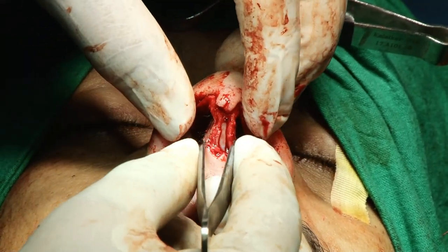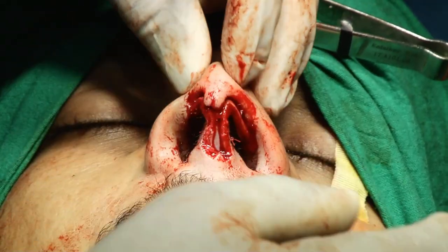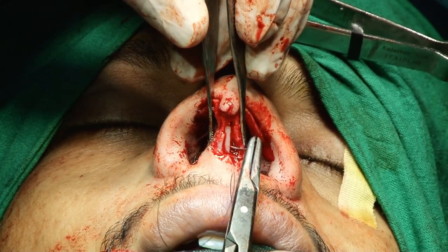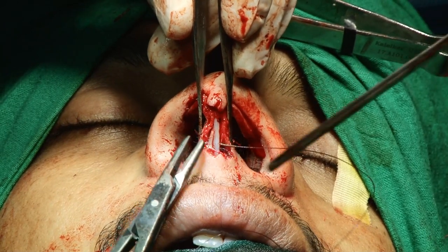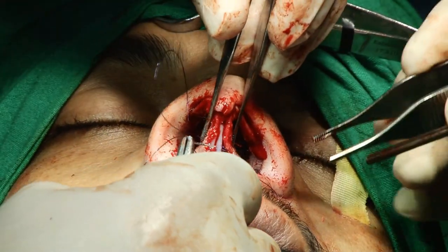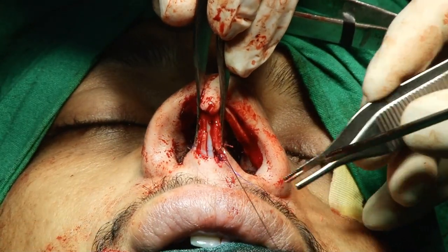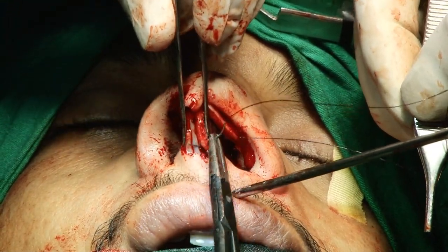Give me the Castroviejo. I need one more suture. This suture goes back from inside to the outside, just like that. Then again, the advantage of this is that the entry and exit of your needle should be on the same level.